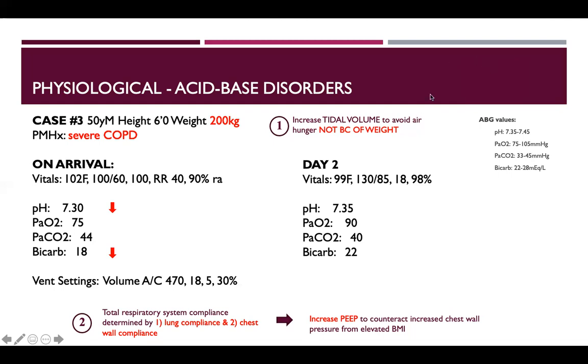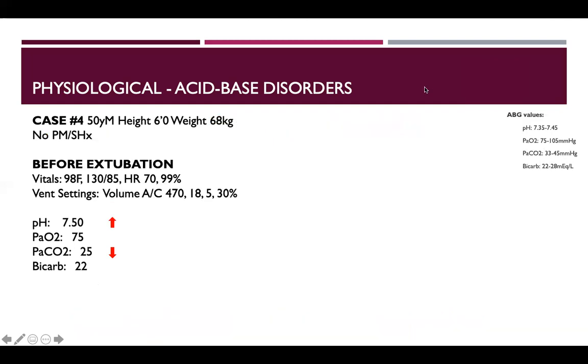So yeah, big point here: ABG looks fine, but you still have to think about the patient's actual clinical picture and their weight for other settings of the ventilator.